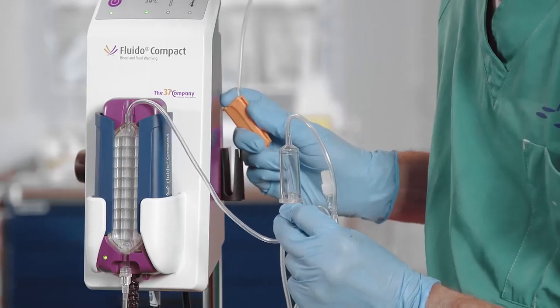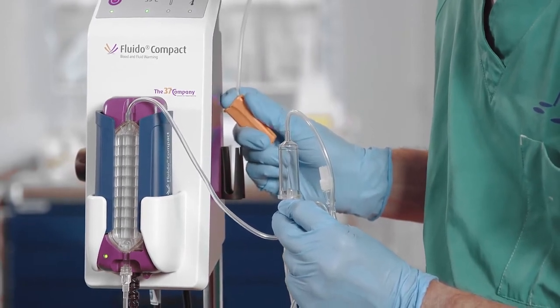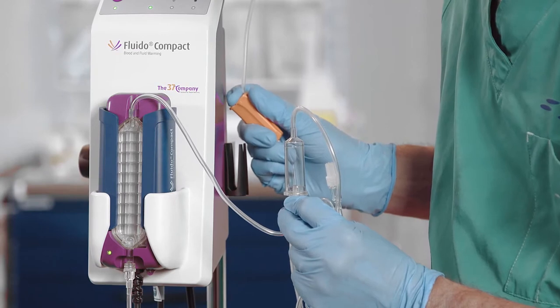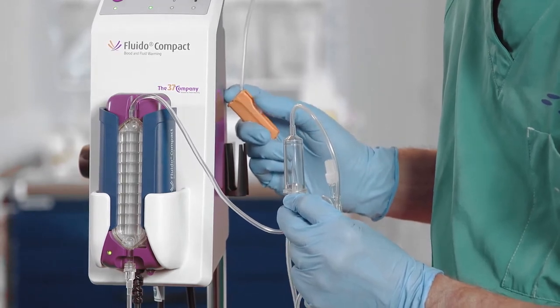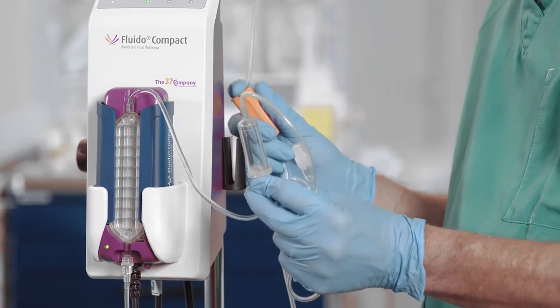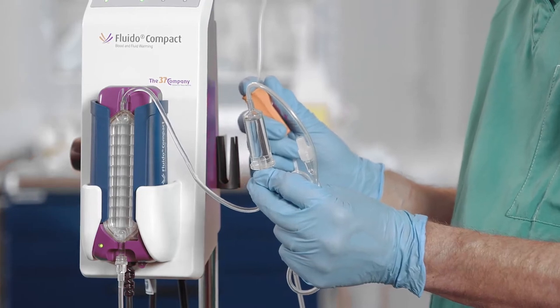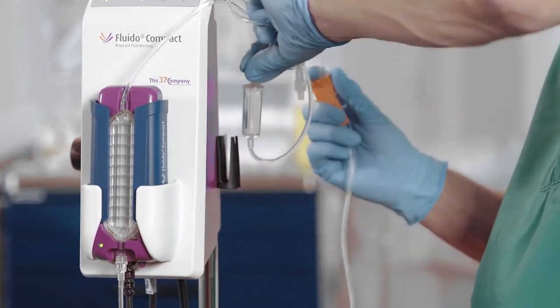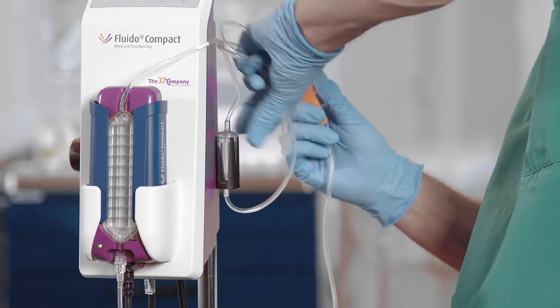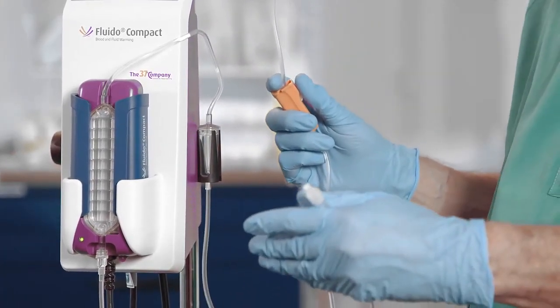To prime the standard set with drip chamber, turn the drip chamber upside down and fill it completely with fluid. Place the drip chamber upright in the drip chamber holder. Make sure that there is no air left in the system and close the roller clamp.